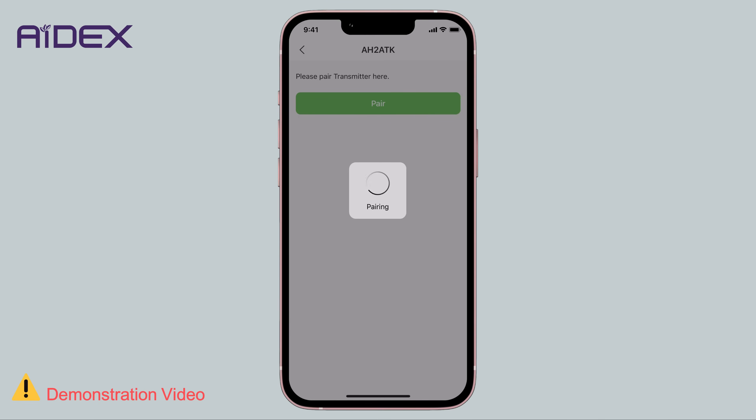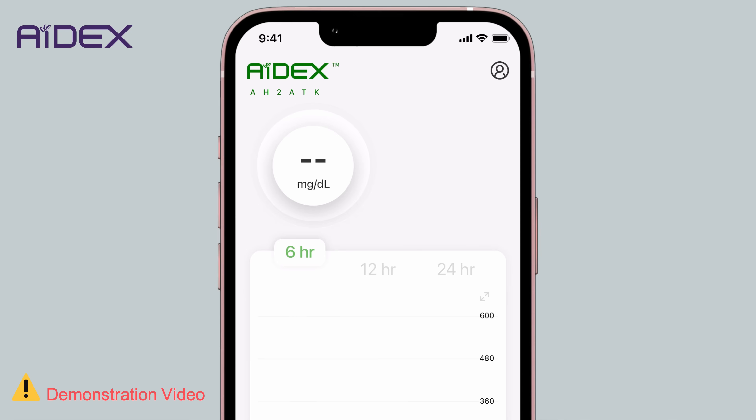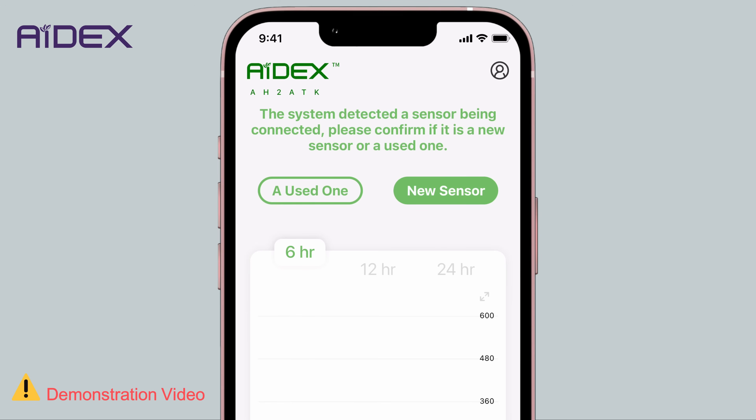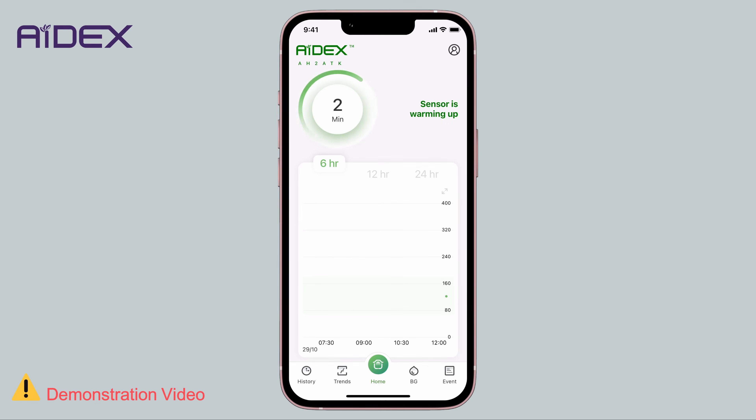The app will attempt to establish a connection with the transmitter. After a successful connection, the app will return to the home screen. You will receive a message indicating the detection of a new sensor. Choose New Sensor to proceed, and the countdown timer will start. Please note that the app may take some time for warm-up and initialization. After about an hour, you should receive your first reading.